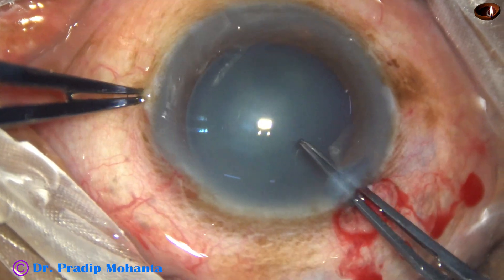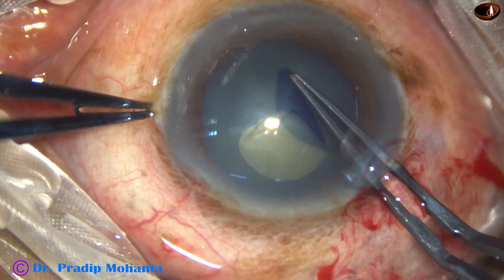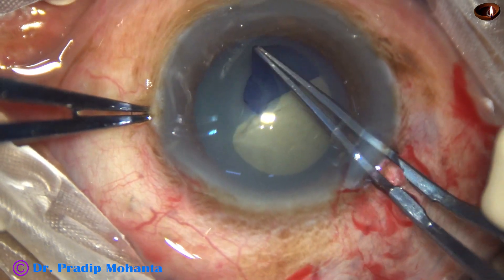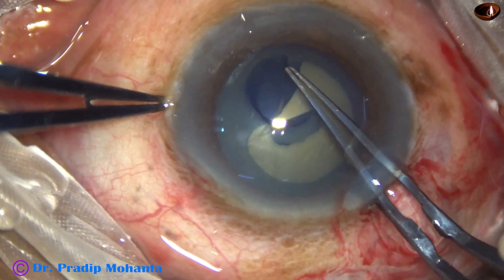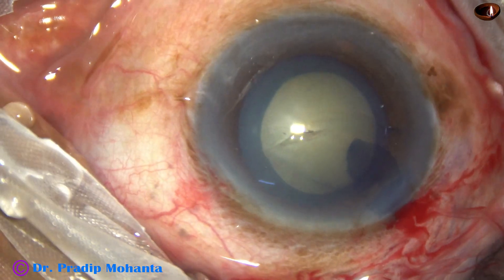And now, capsulorhexis is being done with the help of capsulorhexis forceps. Just pierce the center of the capsule, raise a capsular tag, and guide this tag all around to get an adequate-sized rhexis.